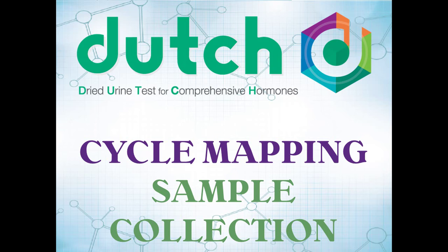This is a Dutch sample collection video. This particular video is to give you instructions if you're collecting for our cycle mapping test.